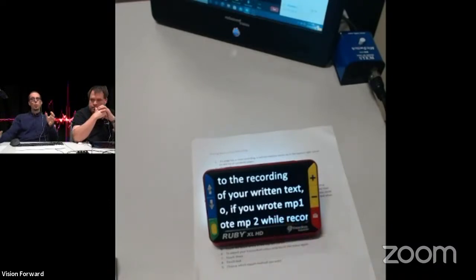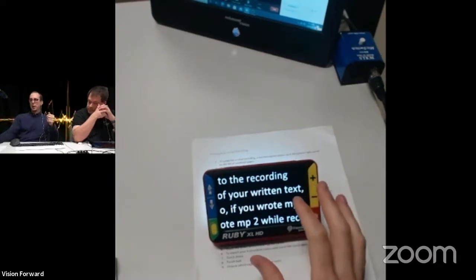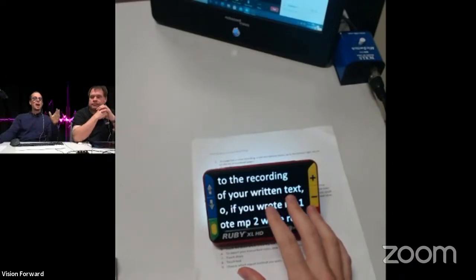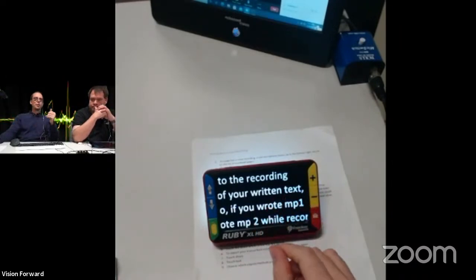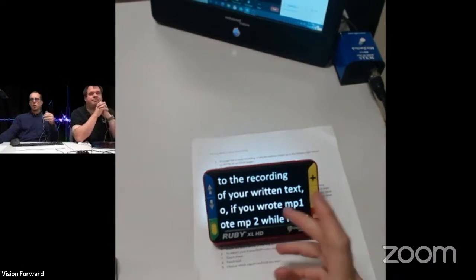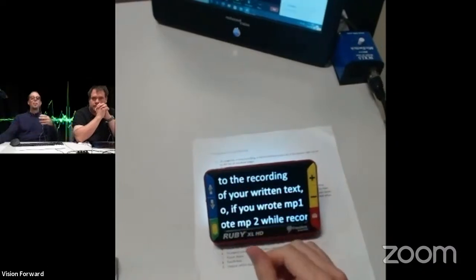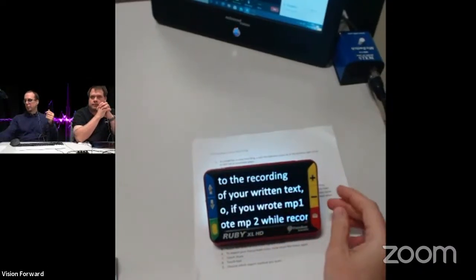And so we're going to have a look at that technology. But if you want something that's able to read the text aloud to you, then some of these devices can do that, as well as displaying the text on the screen as it's being read. Sure. And so even for people with other print disabilities that aren't necessarily low vision related, that type of technology can be useful for sure.